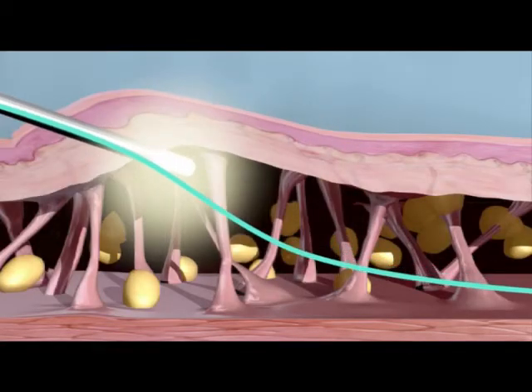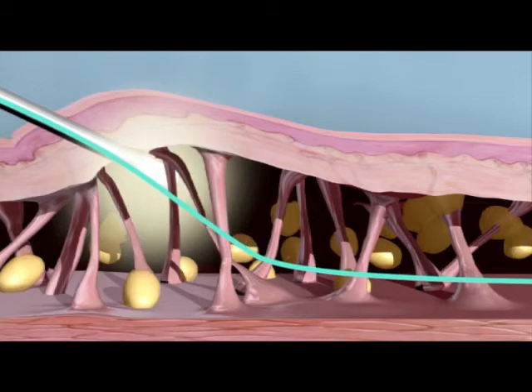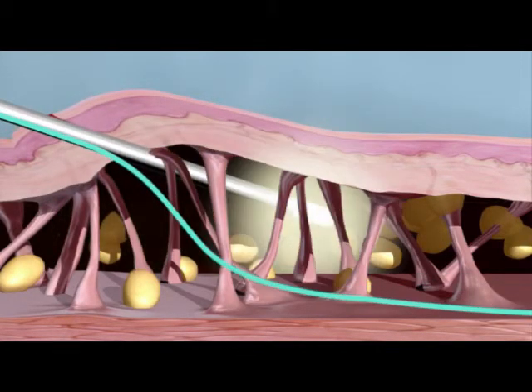Once again, illustrating the rod as it is rotated, encircles the ligaments, and then engages and is advanced downward underneath the jawline.